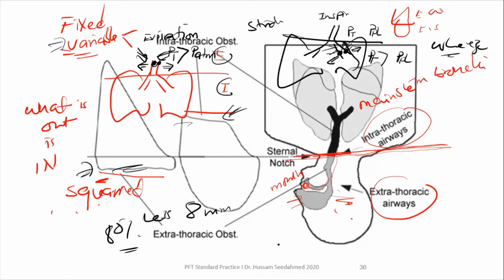So it is a bit late. Patients with late manifestations of obstruction will have such a degree, or the flow volume loop will be affected. This means that in early stages of obstruction the flow volume loop will be normal.